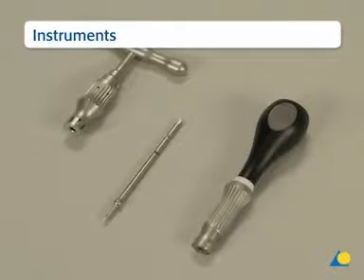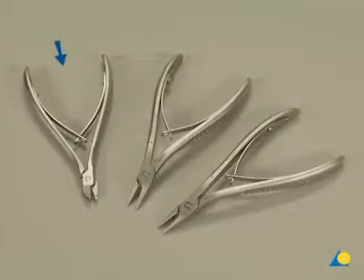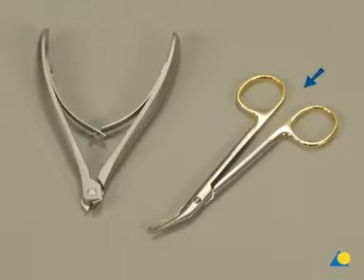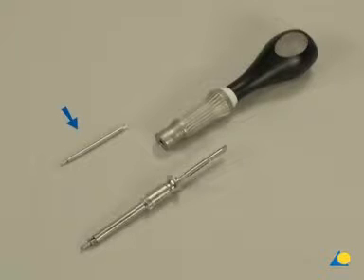The matrix mid-face instruments needed are: the 2.4 mm self-drilling threaded reduction tool with the T-handle and the screwdriver handle, the in-plane plate bender, two standard plate benders, the plate cutter, the mesh cutting scissors, the mini plate holder, the 1.1 mm drill bit with 6 mm stop, the screwdriver handle, and the screwdriver shaft with spring holding sleeve.